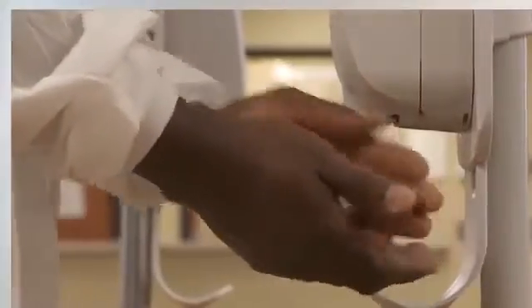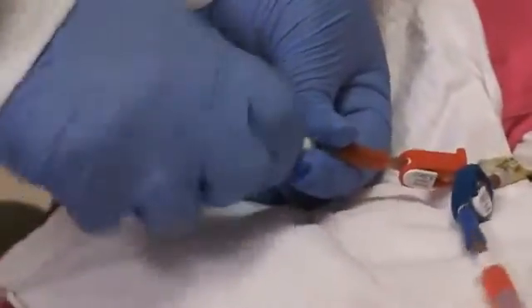Attach new sterile caps using aseptic technique, remove your gloves, and perform hand hygiene. You should scrub the hub anytime there is a line disconnection or reversal. Following the scrub the hub protocol and paying close attention to aseptic technique will help prevent bloodstream infections.